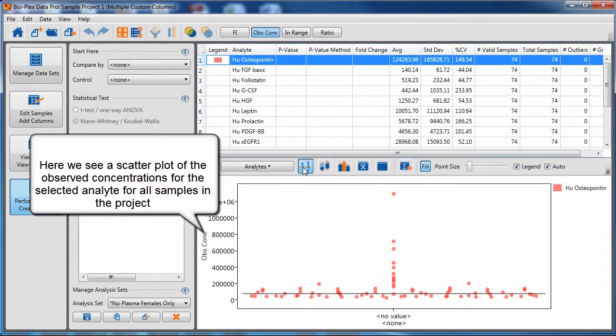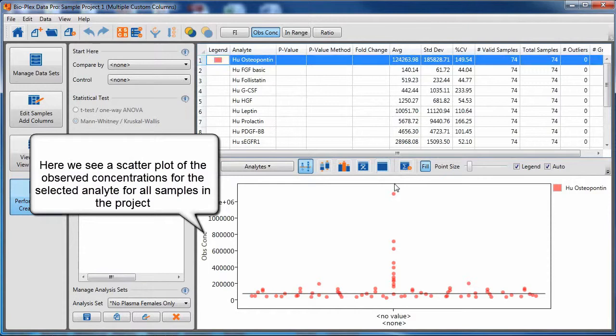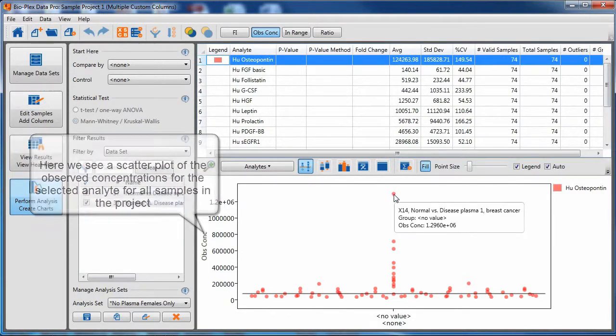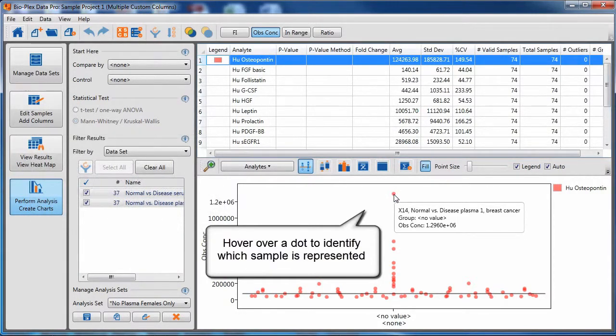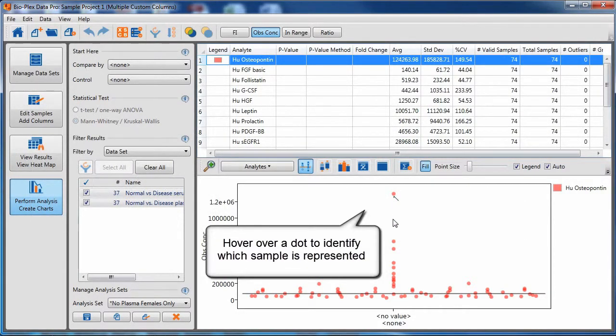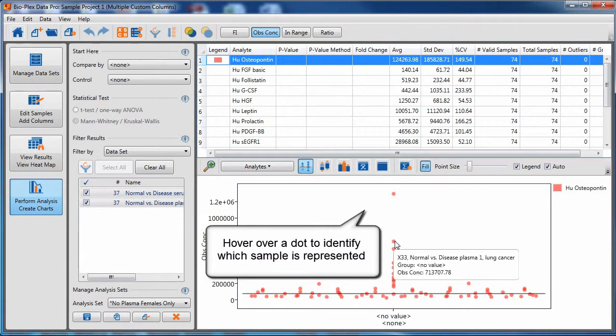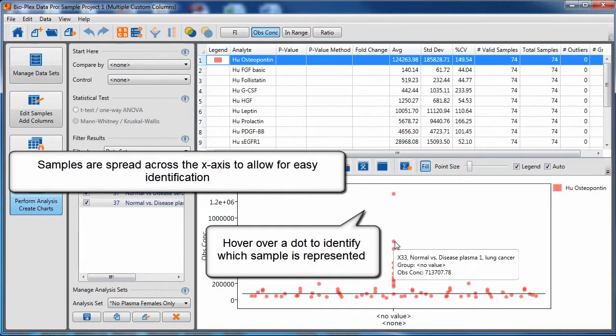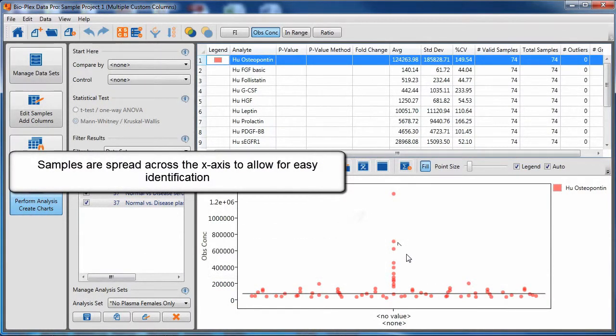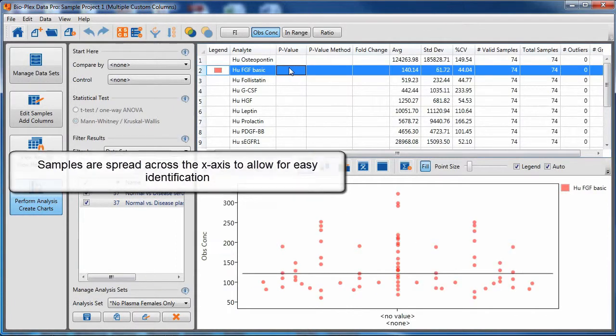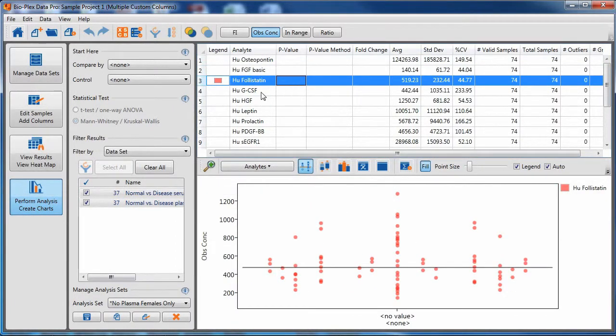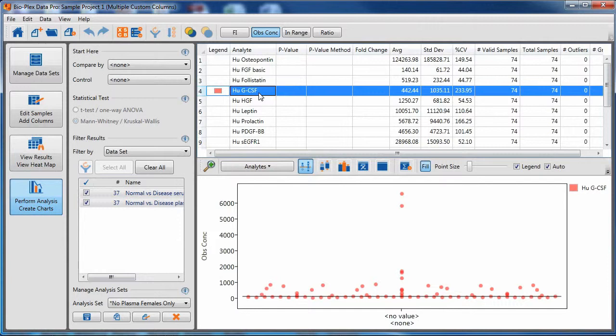Here we see a scatter plot which represents all the samples in the project. You can hover over a dot to identify what sample that represents. The x-axis of this graph has no scale. The samples are spread across the x-axis in order to more easily identify individual samples.